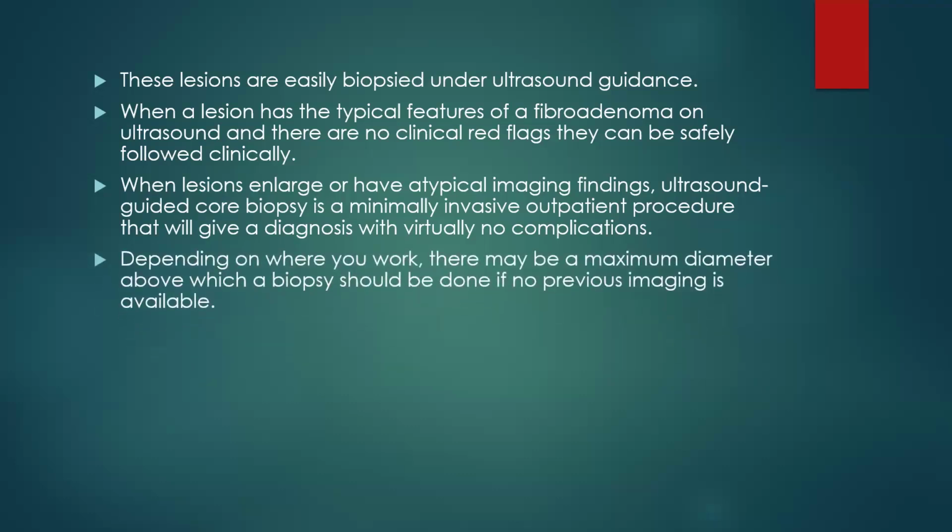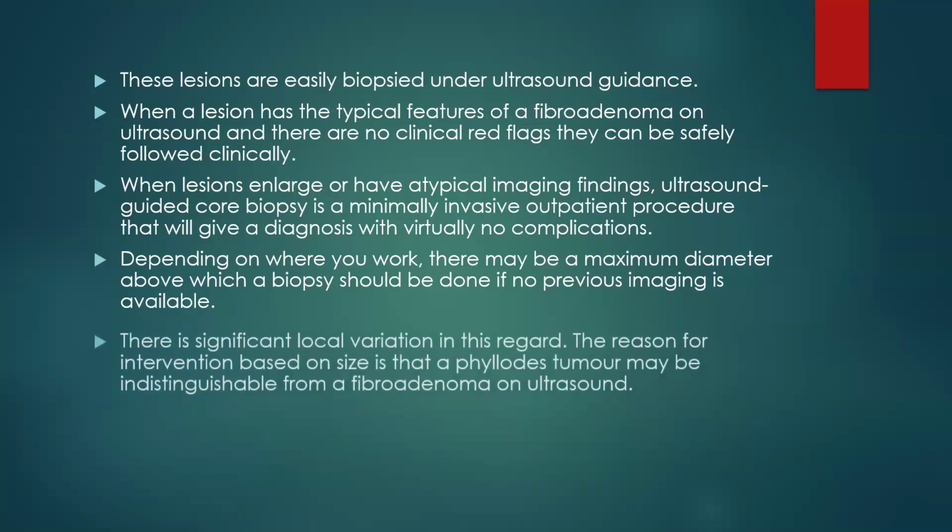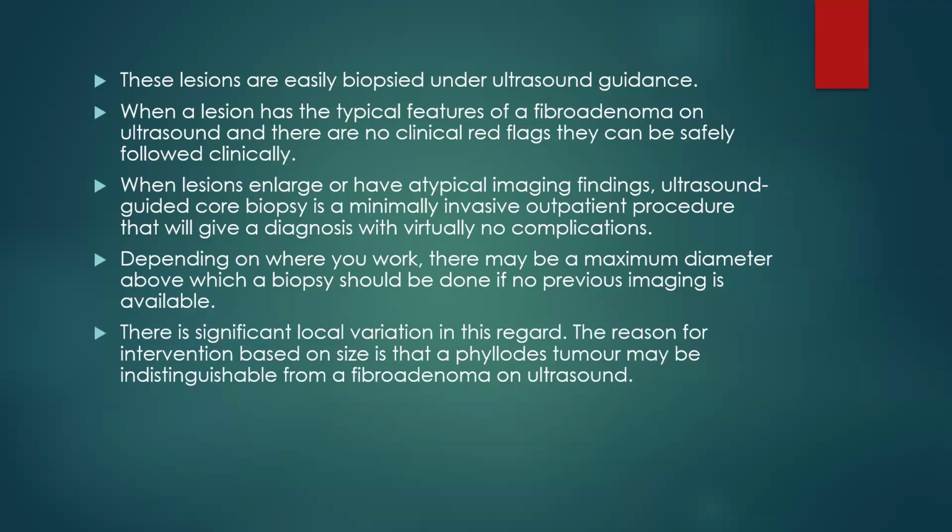Depending on where you work, there may be a maximum diameter above which a biopsy should be done automatically if no previous imaging is available to compare the interval growth of the mass. And there is significant local variation in this regard.